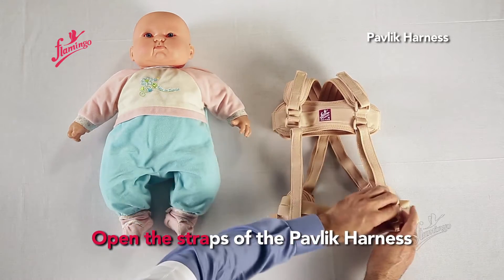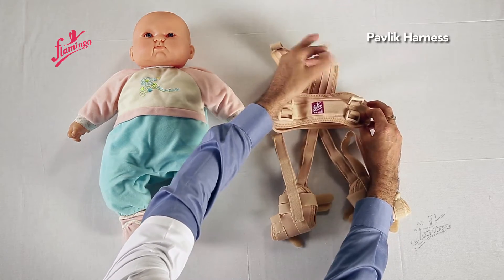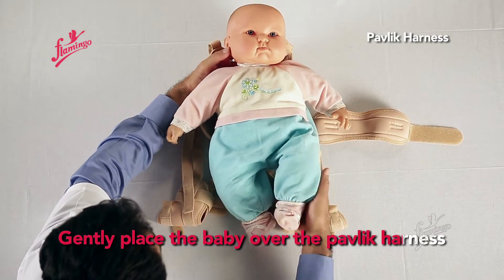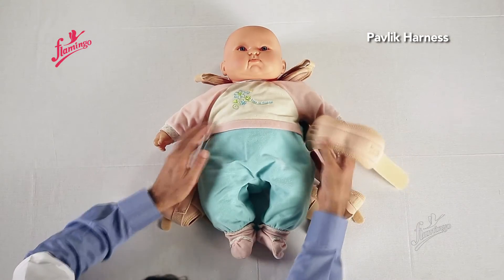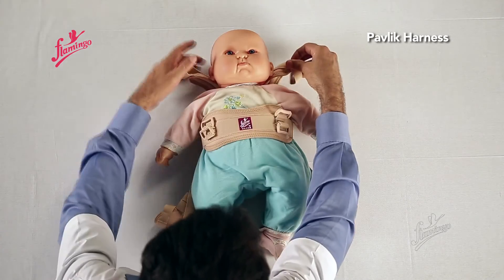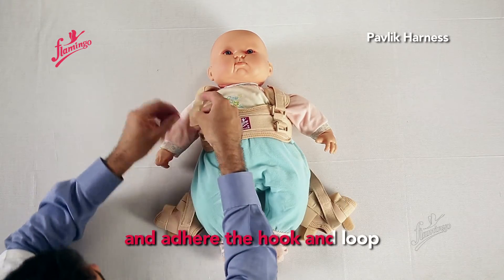Open the straps of the Pavlik Harness. Gently place the baby over the Pavlik Harness. Position the chest halter and pull the shoulder straps over in the front. Pass the shoulder straps through the ring and adhere the hook and loop.